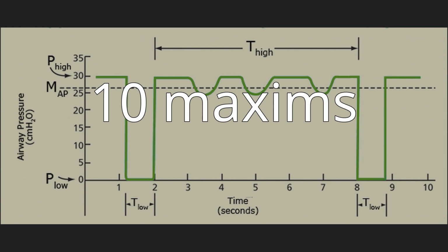A breath is assisted if the ventilator does work on the patient. An assisted breath is one for which the ventilator does some portion of the work of breathing. For constant flow inflation, work is defined as inspiratory pressure multiplied by tidal volume. Therefore, an assisted breath is identified as a breath for which airway pressure displayed on the ventilator rises above baseline during inspiration. An unassisted breath is one for which the ventilator simply provides the inspiratory flow demanded by the patient and pressure stays constant throughout the breath.